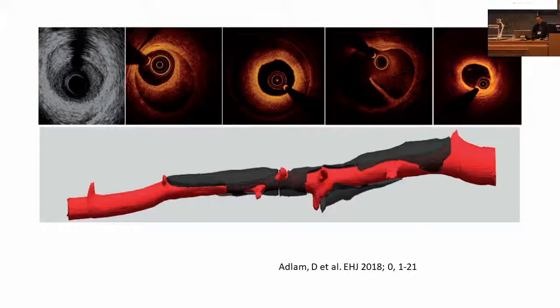This slide basically wants to illustrate to you that when you do an OCT, we cut it section by section, at different points. In this particular case where this is dissected, the black is the hematoma, and you can see that the hematoma twists and turns and spirals around.